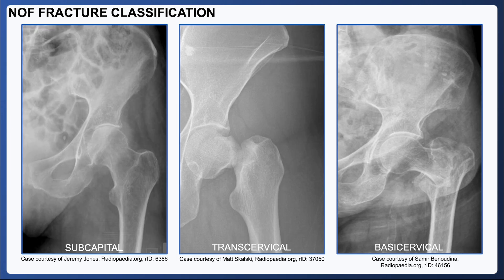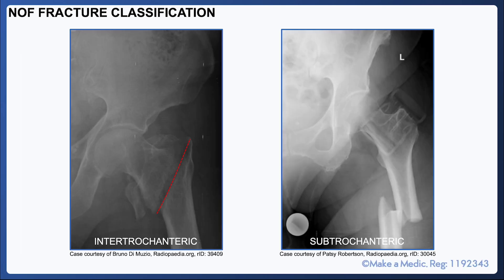Here are some real-life examples of different types of hip fracture. The subcapital fracture is subtle, but you can see a little notch that disrupts Shenton's line at the junction between the head and neck of the femur. This is a transcervical fracture that goes through the neck of the femur, and on the right is a basicervical fracture. And finally, here's an example of an intertrochanteric fracture and a subtrochanteric fracture.